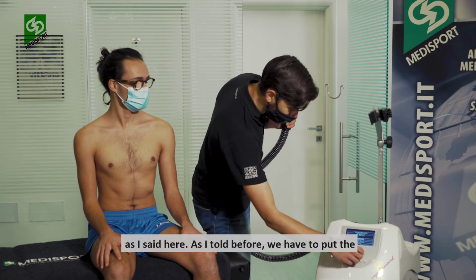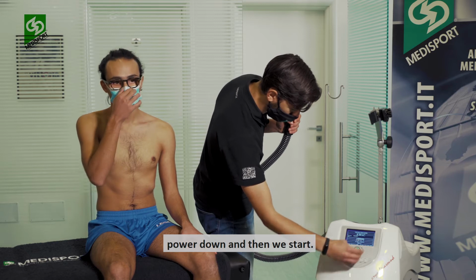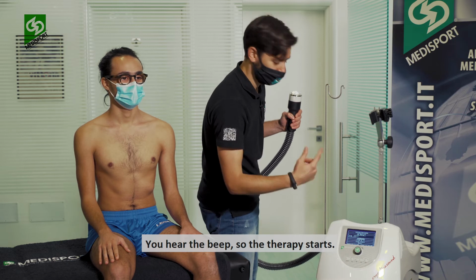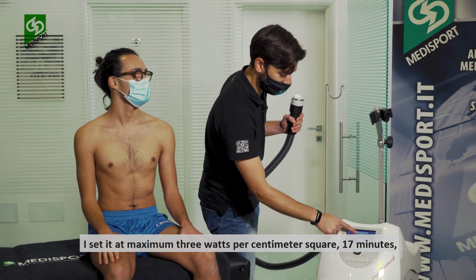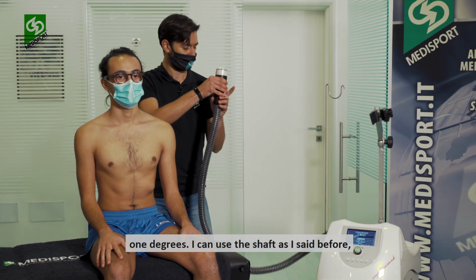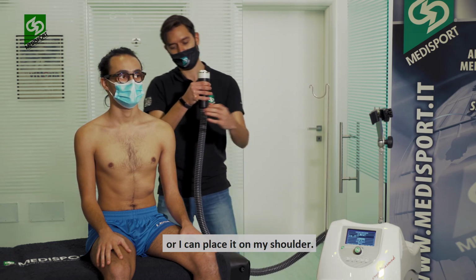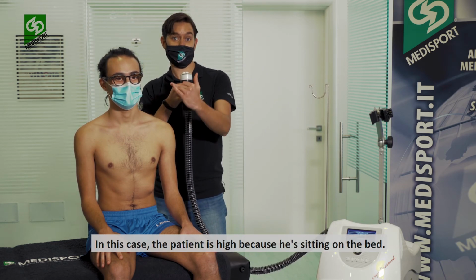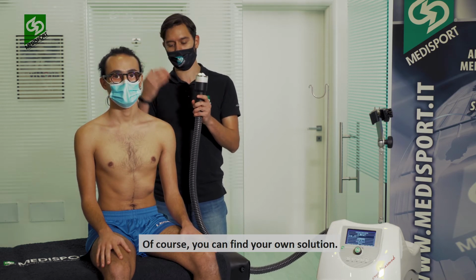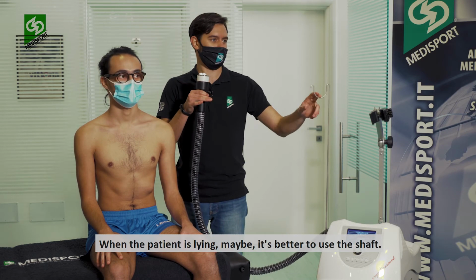Okay, so as I told before, we have to put the power down, and then we start. You hear the beep, so the therapy starts. I set it at maximum, 3 watts per centimeter square, 17 minutes, 1 degree. I can use the shaft, as I said before, or I can place it on my shoulder. In this case, the patient is high because he's sitting on the bed, so I will place it on my shoulder. It's a bit more comfortable. Of course, you can find your own solution. When the patient is lying, maybe it's better to use the shaft.